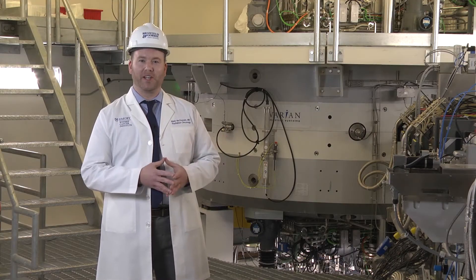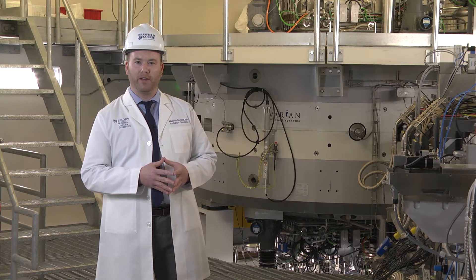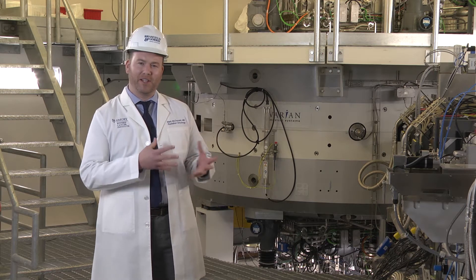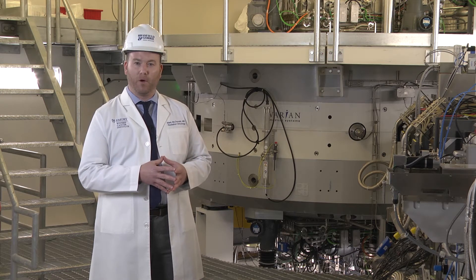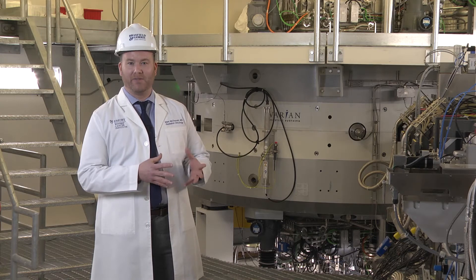As a superconducting cyclotron, it's cooled with liquid helium to about 4 degrees Kelvin, which is about negative 452 degrees Fahrenheit. This allows the cyclotron to be smaller and more efficient. Still, it weighs about 90 tons and is 10 feet in diameter.